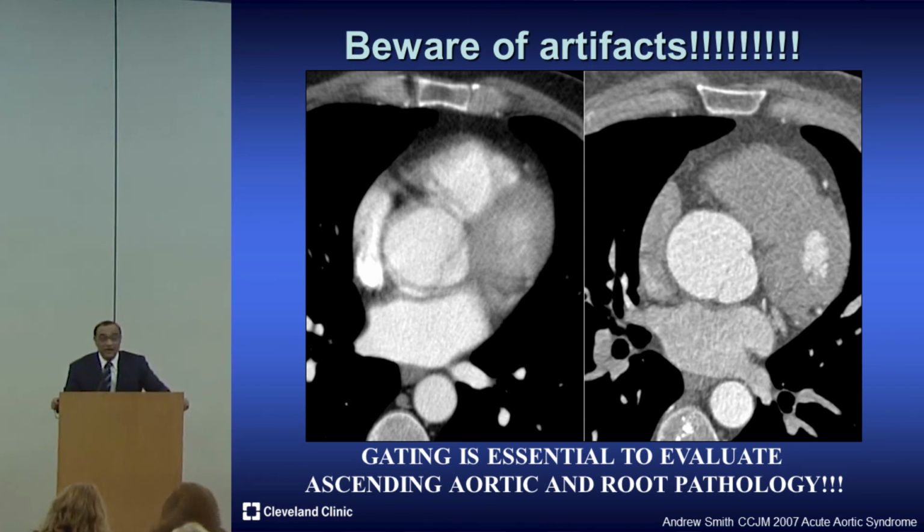Patient education is patient empowerment. You need to ask your doctors, was my CAT scan done with gating? G-A-T-I-N-G, gating. Does the radiologist know to use 3D reconstruction to measure the dimensions? These are crucial questions you need to be asking.